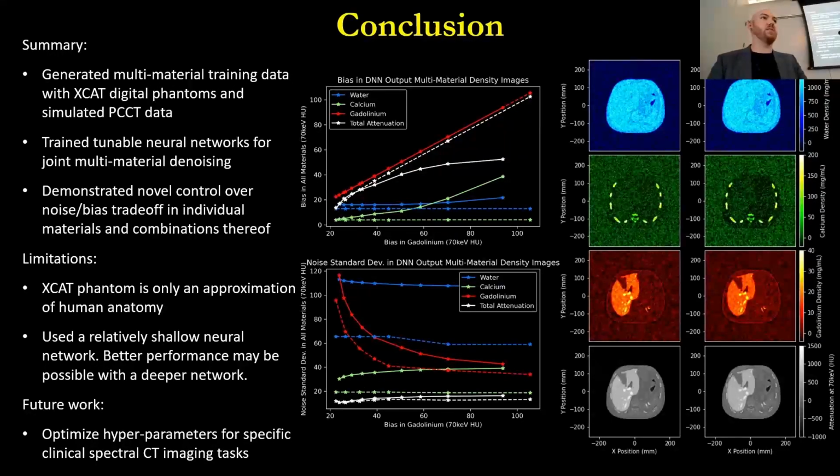But yeah, this is still in its preliminary stages, but I see this as giving us a design space, bringing back some actual engineering to these machine learning algorithms so we can control image properties. And like we saw earlier today about task specific objective image quality optimization, that's where I see this going, is picking some specific tasks and optimizing the image quality for those tasks. Okay, we'll look forward to that. Thanks.